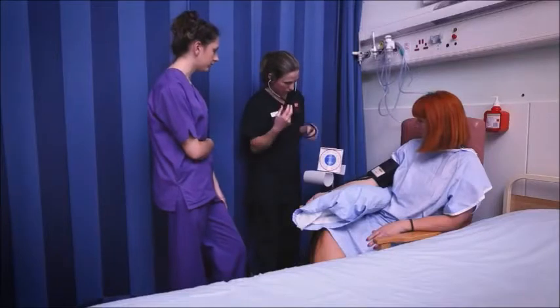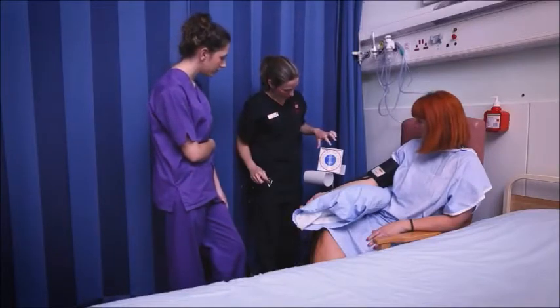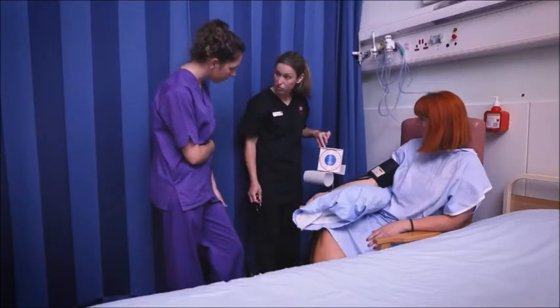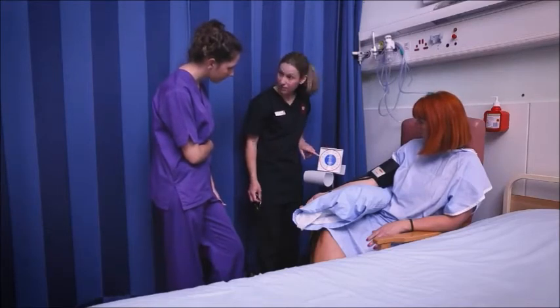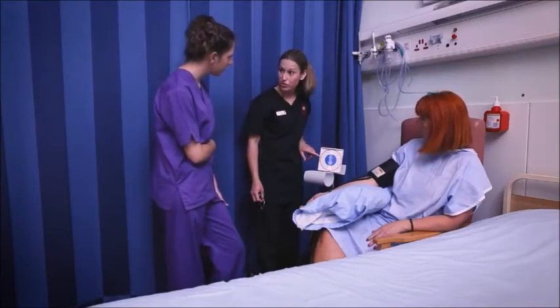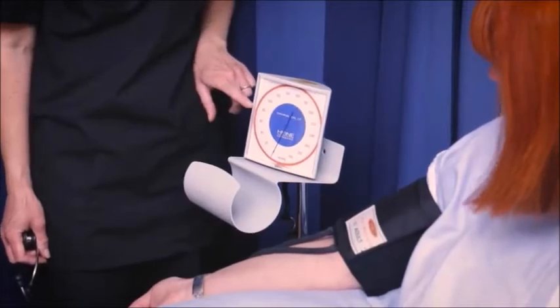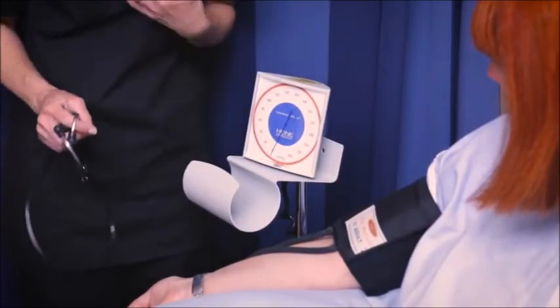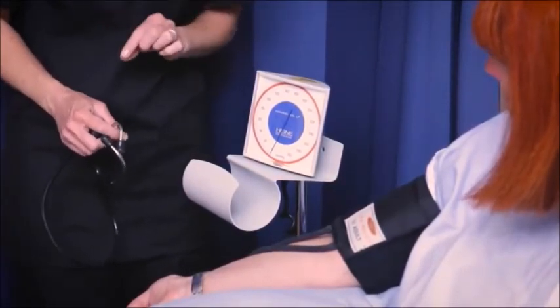So when we let the cuff down, I could hear the first tapping sound at about 120, and the sound disappeared at 78. So that would be 120 over 78. So after the reading, it's important to document it very carefully in the notes.